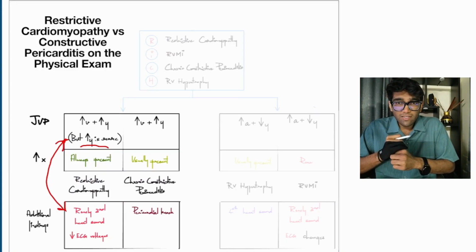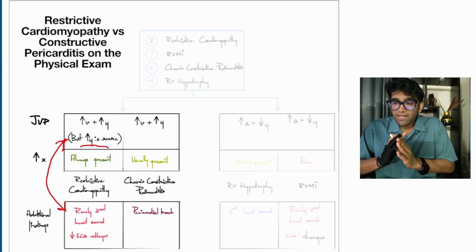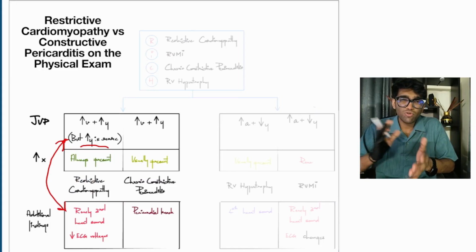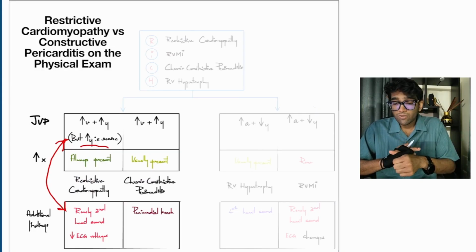As a result, even though the wall of the ventricle is thickened or even normal on imaging, the ECG shows low voltage complexes because there is a non-conducting material in between the myocardium and the surface lead that you placed on the chest. So you may have decreased ECG voltages, but this is much more so with amyloidosis and not with other cases of restrictive cardiomyopathy. So this is not something that we can reliably use.